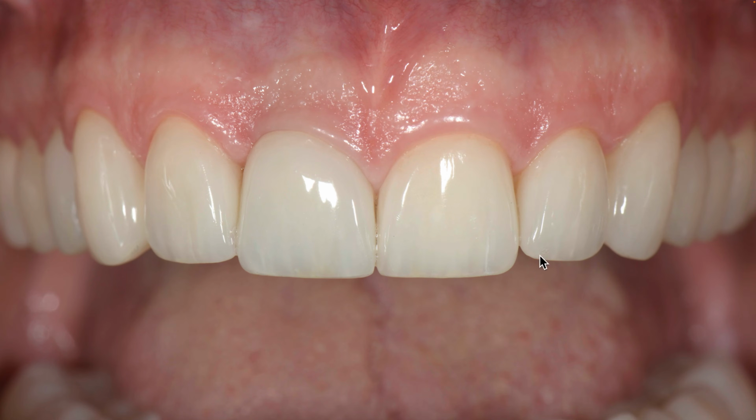So here's the upper. You can see the tissue looks really healthy around the implant, and I think it's fairly symmetrical with the other central, even though both of them are a little shorter than the laterals, but it's okay because of his lip line. And I think it looks like natural, beautiful aesthetics.